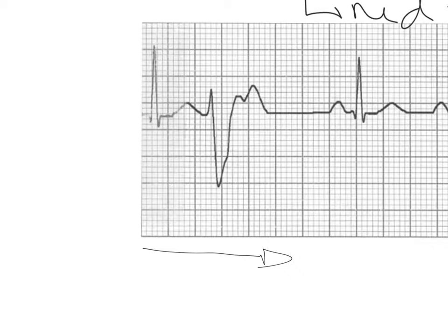Think back to high school geometry, math, wherever you saw this stuff first. This horizontal axis is called my x-axis, okay? This x-axis is going to be a measure of time. It's going to be a measure of time.